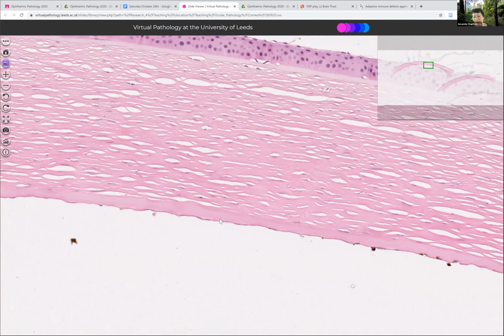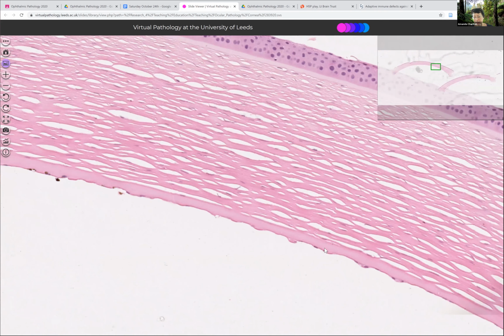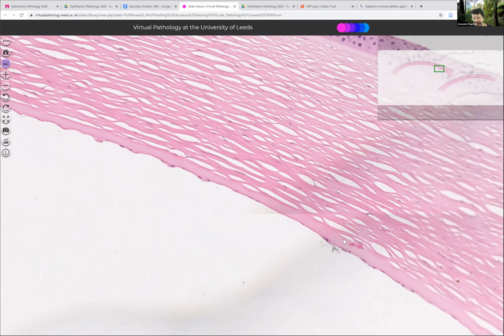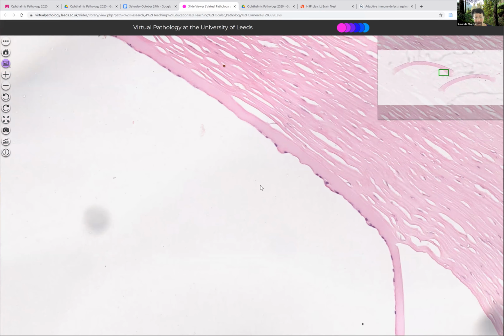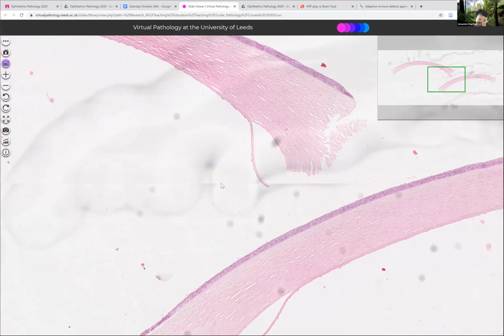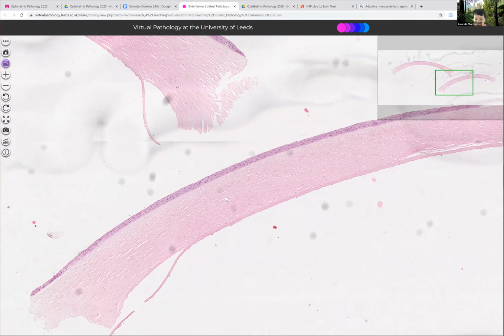And I'm looking here at the posterior surface. I'm coming across these little bumps, like little mushroom excrescences occurring on the posterior surface of Descemet's, and endothelial cells are still present, but somewhat sparse. This lumpy look, they look like guttata to me, and they're in the right place for guttata. So I'm thinking about Fuchs dystrophy in this location. And if it is Fuchs, sometimes it's associated with corneal edema, but I don't think that we have evidence of that here.